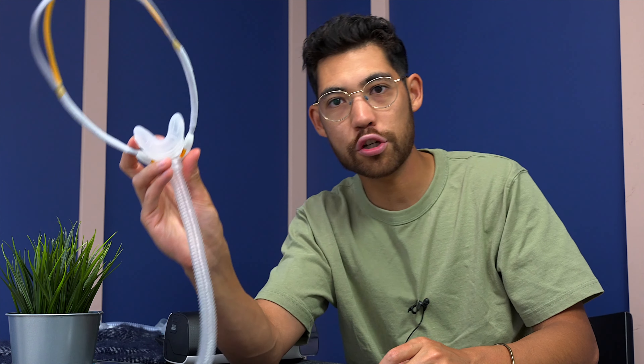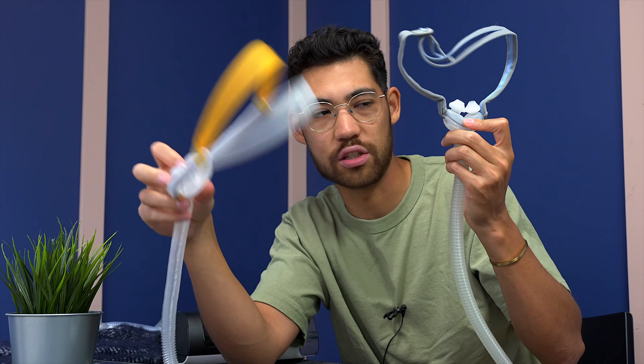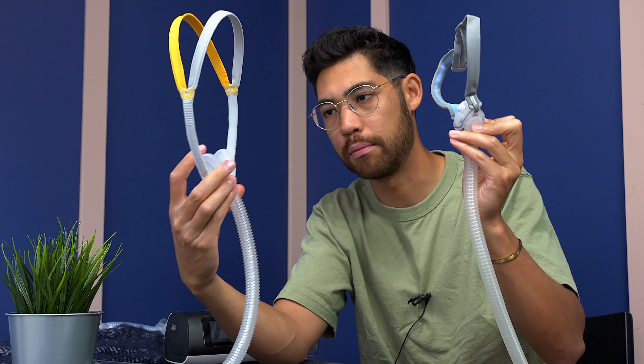What's up guys, Tristan from cpapstore.ca. Today we're going to be looking at the Fisher & Paykel Solo mask versus the ResMed P10. Which one is better? This one is newer, but this one is the tried and true classic. What is the better minimal mask?